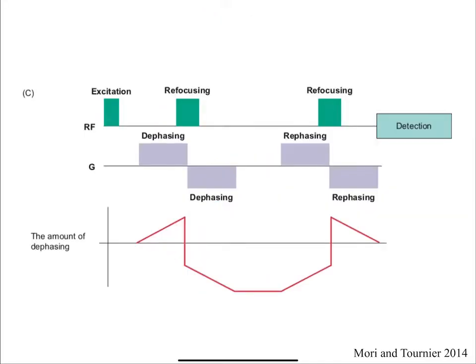And what's actually used in practice in almost all modern studies, say HCP or ABCD, is what's called a dual spin echo. So there are two 180-degree pulses. It just turns out that this has slightly better properties for handling what are called eddy currents, which we'll talk about next lecture. So this has been adopted by the field. But it's the same principle. Essentially, these gradients here are what cause diffusion weighting.